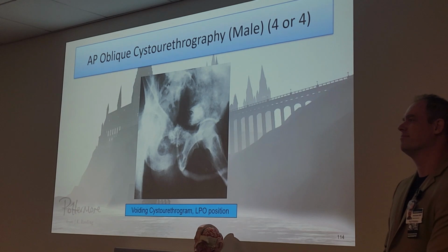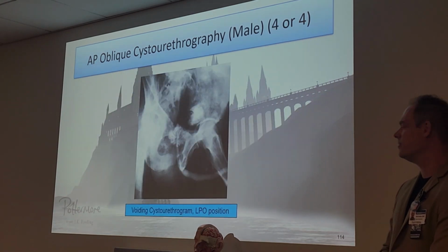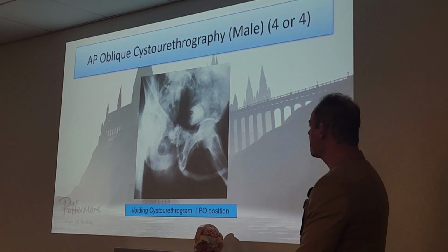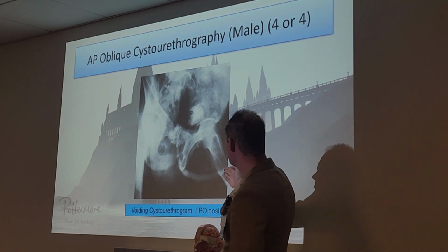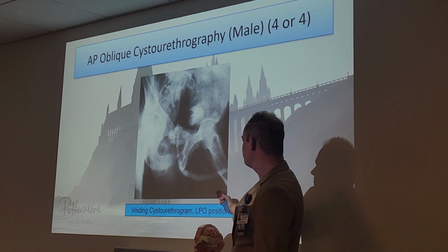Oh, I have 2. There will be your LPO. That was the RPO. There's your LPO. And this placement, not very good. You want the placement to be along the thigh right here.